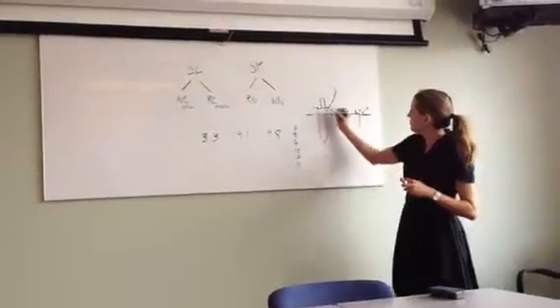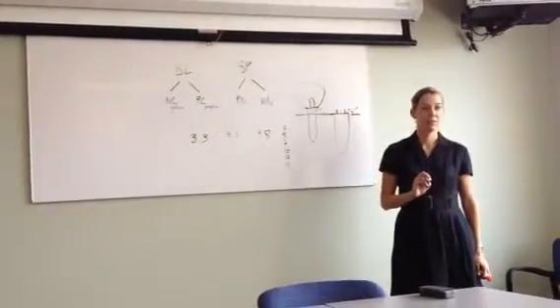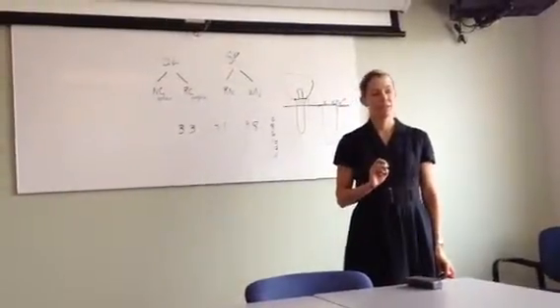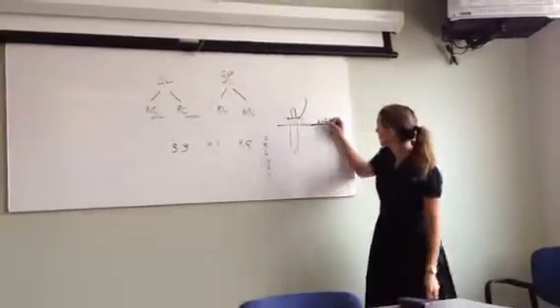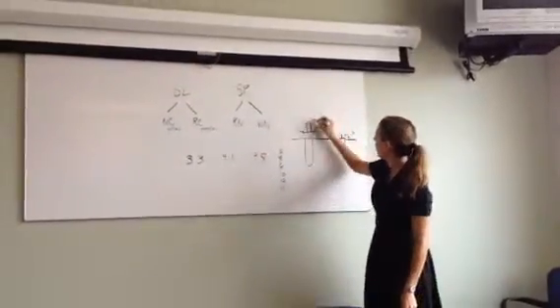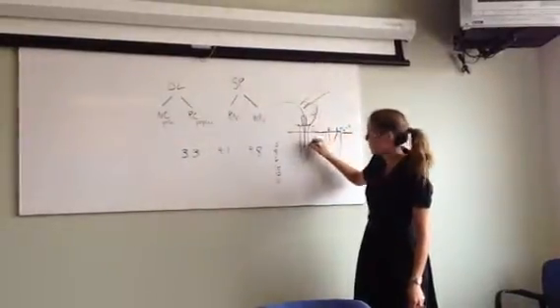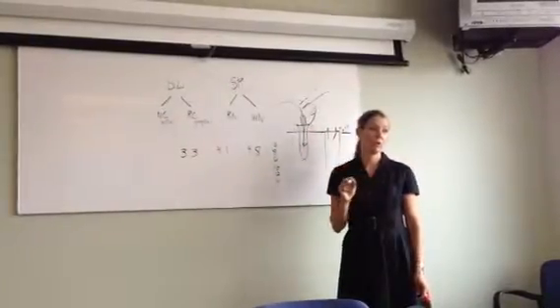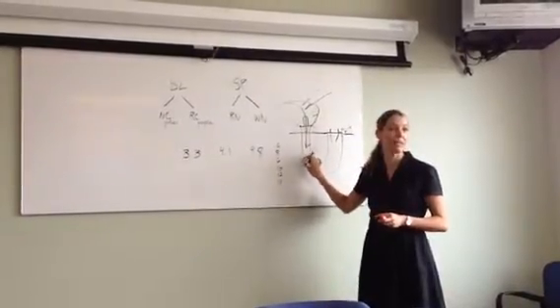Do you remember what the Morse taper is? A taper on the inside that distributes the forces more evenly through the abutment into the implant. Yes, exactly. So the Morse taper, we have a 15-degree taper on the bone level and an 8-degree taper on the tissue level. So all these forces that come into the crown get distributed down into the osseointegrated implant, so the threads of the screw do not take the load. Only 9% of the load is taken by the connection, 91% is actually taken by the integrated implant.